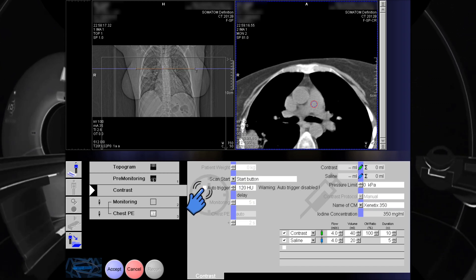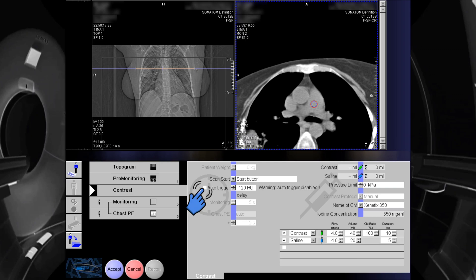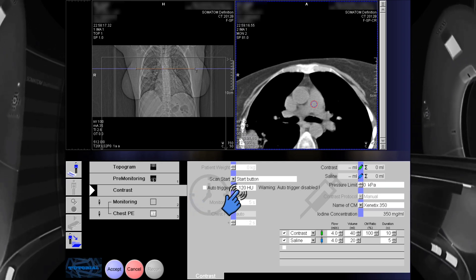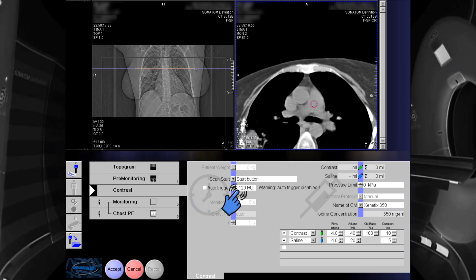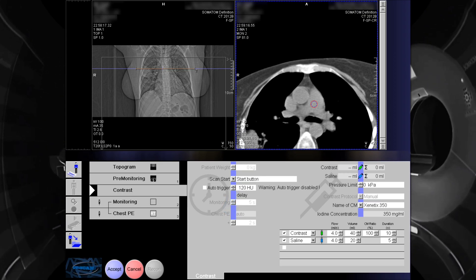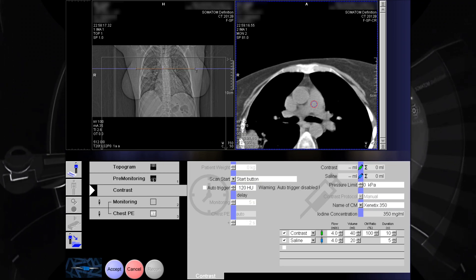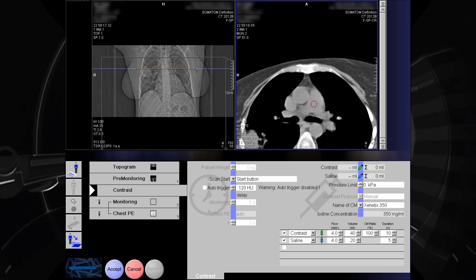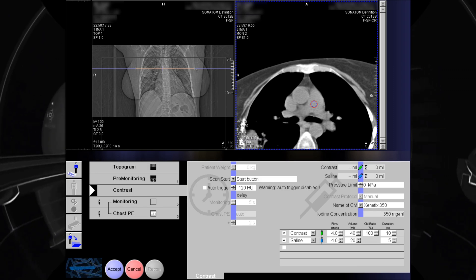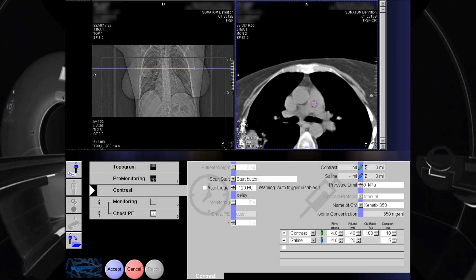Here, we have an option to enable or disable the auto trigger. If auto trigger is enabled, we need to set the number of Hounsfield unit. When the desired Hounsfield unit has been reached, it will start scanning automatically. In this case, we are going to disable the auto trigger.